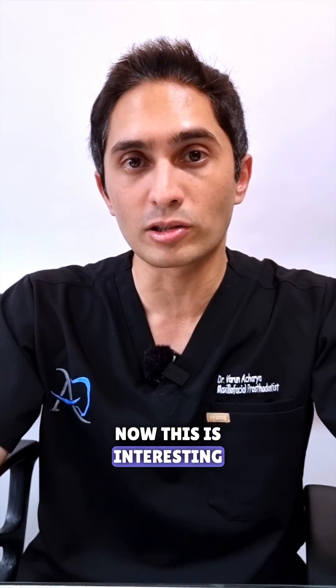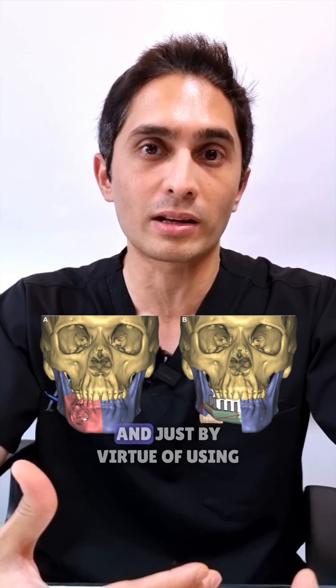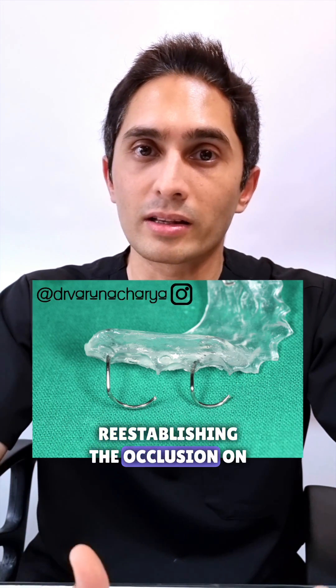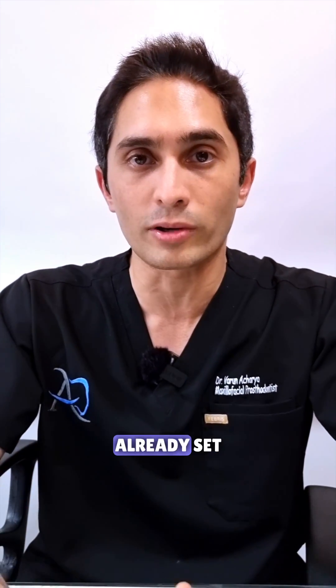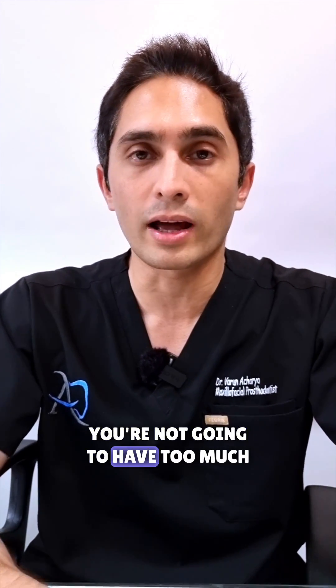Now this is interesting — this lady is going to get a fibular reconstruction, she's going to get implants placed, and just by virtue of using this guide flange prosthesis and re-establishing the occlusion on the left side, it's going to be so much easier to reconstruct on the right side because the occlusion is already set. So once the fibula is in and once the implants are placed, you're not going to have too much of a difficulty in making a prosthesis for her.